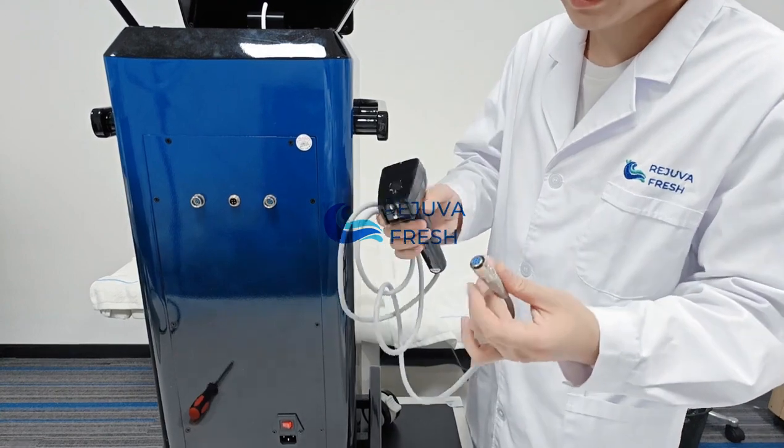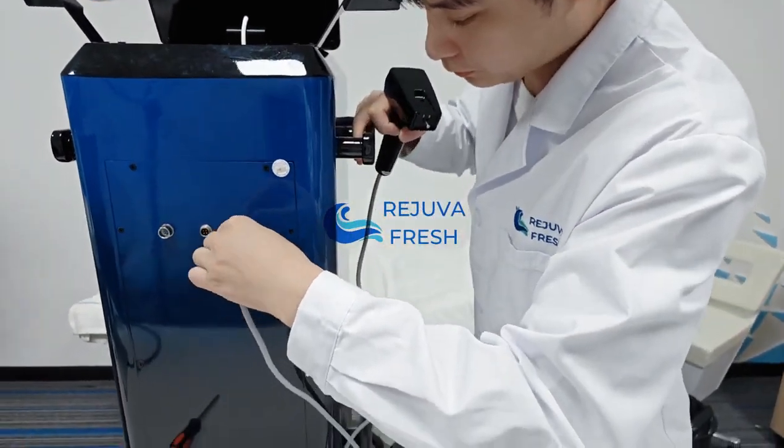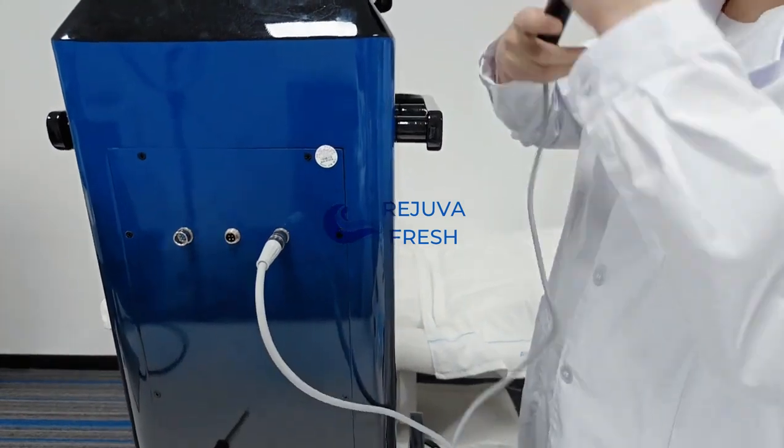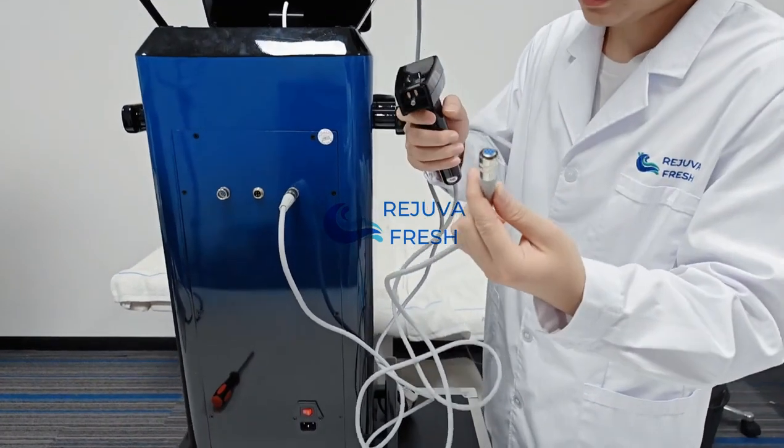The second step is to connect the handles with the main machine. Then the second handle.